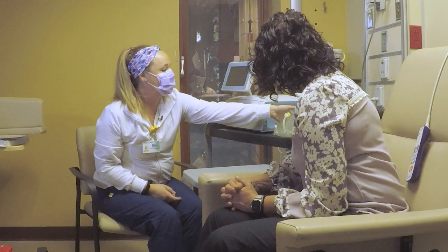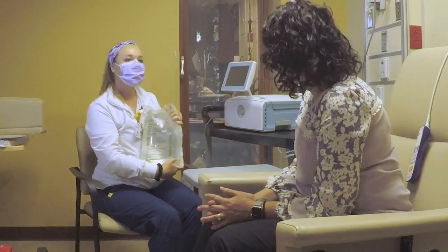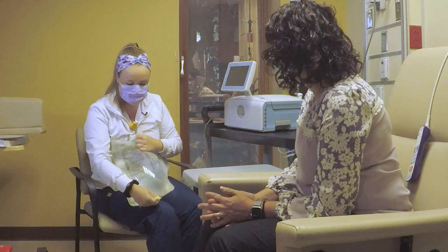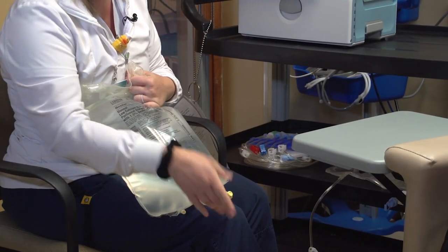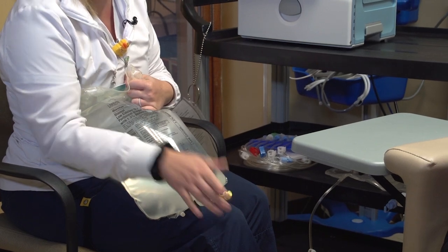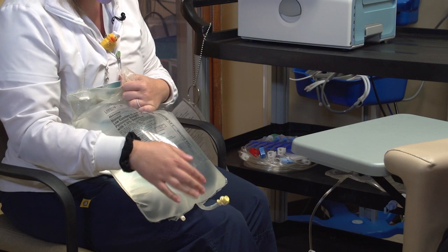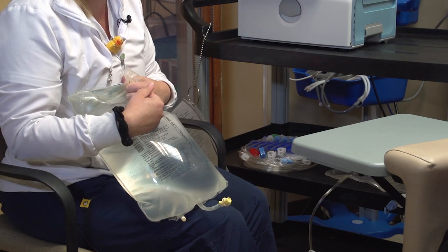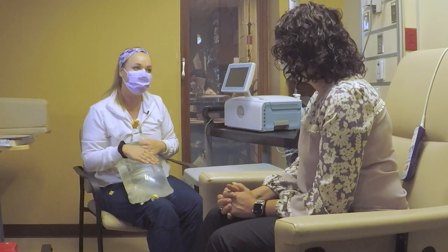Okay. This is your solution, the dialysate that you would use. As you can see, this one is yellow. We do have a couple different colors. We have yellow, we have green, we have red, and then we have a purple. Each one has a different concentration of dextrose solution in it that kind of helps with determining how you're going to dialyze for that treatment.